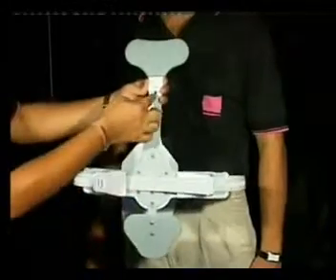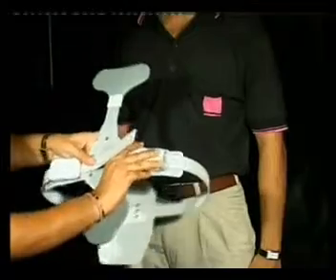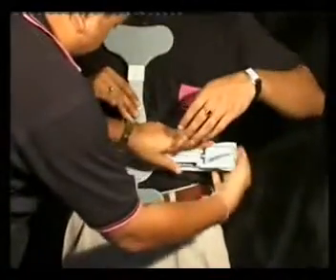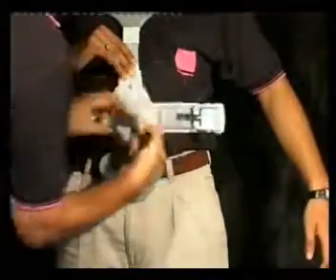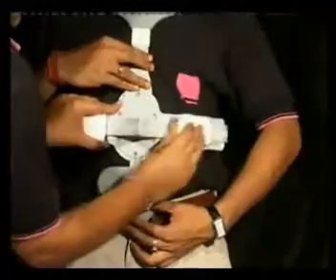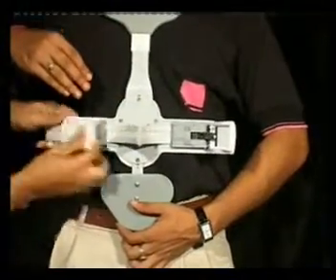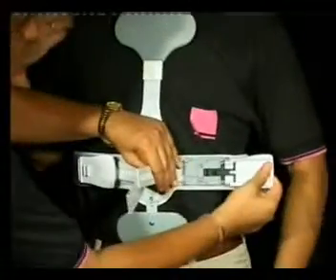If it is long, we can put the key here and fix it accordingly. Application is very easy. You can see it is bending and adjusting with the body structure.